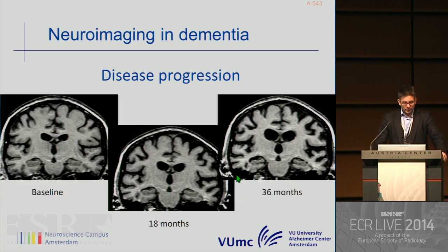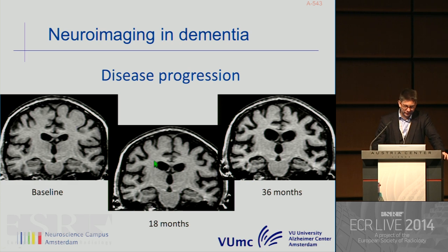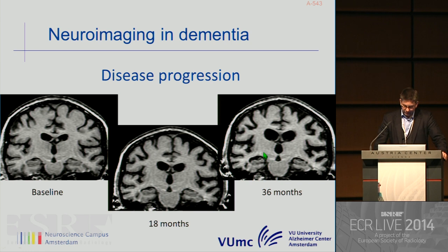Beyond this, we can also try to monitor disease progression and treatment of dementia. This is a patient coming to us at baseline with mild cognitive impairment. You can see very nicely that during follow-up the atrophy—the neurodegenerative changes—become more prominent, particularly in the medial temporal lobe but also in the global cortex, and this becomes more evident in later follow-up. You see a very nice view of medial temporal lobe atrophy, particularly on the right side, and also more pronounced global cortical atrophy.